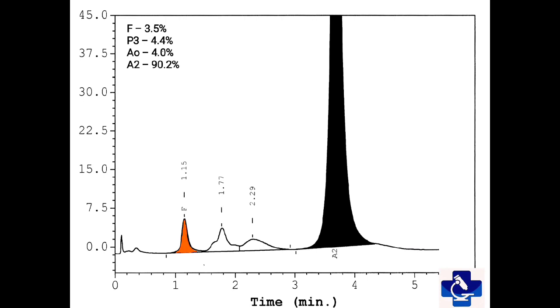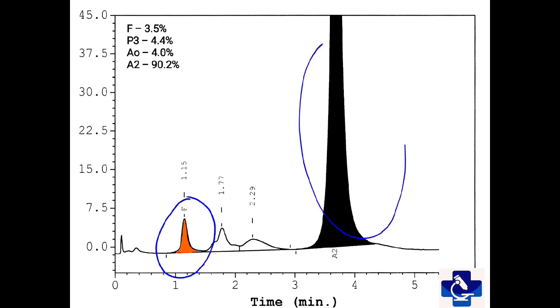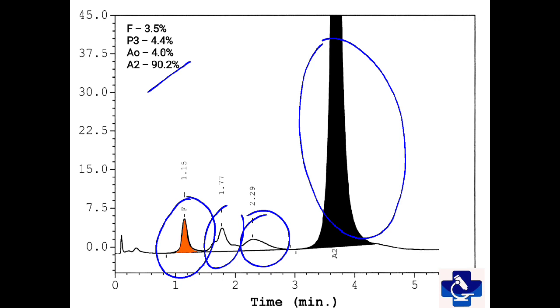In this case, HbF is mildly raised around 3.5%. We have the major fraction here that is A2, above 90%. P3 is around 4.4% and A0 is around 4.0%. This case is that of hemoglobin E homozygous, and the A0 is actually glycated HbE.